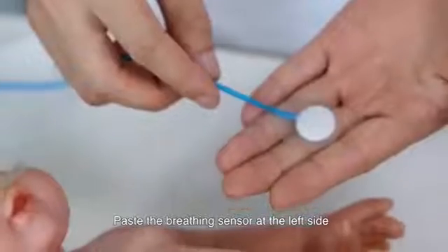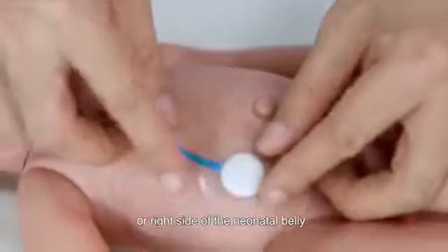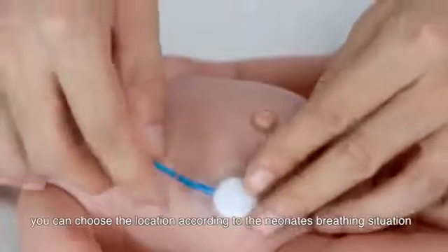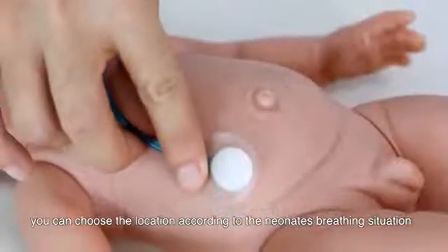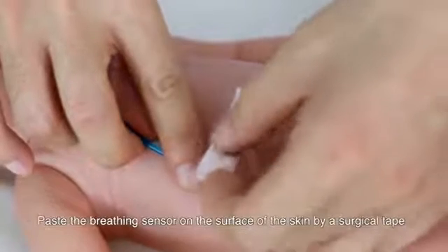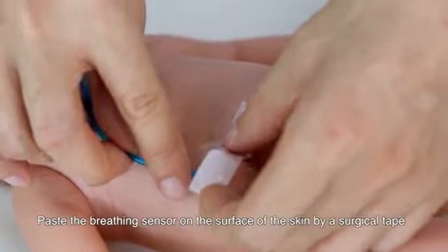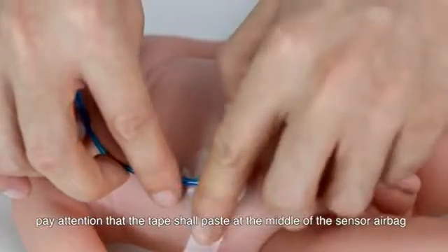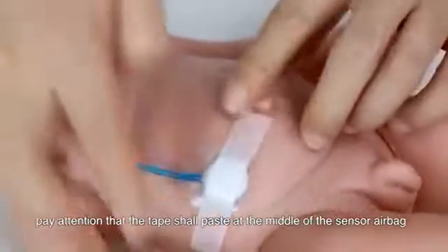Place the breathing sensor at the left side or right side of the neonatal belly. You can choose the location according to the neonate's breathing situation. Paste the breathing sensor on the surface of the skin with surgical tape. Pay attention that the tape shall be pasted at the middle of the sensor airbag.